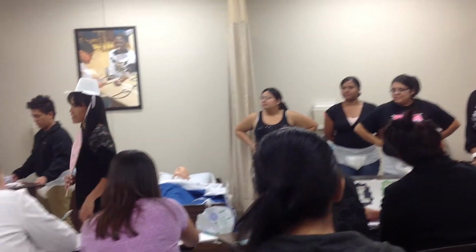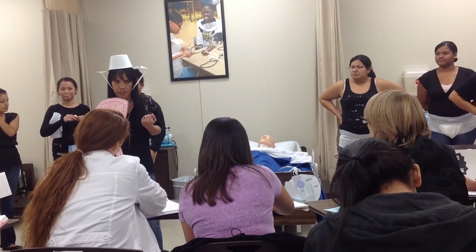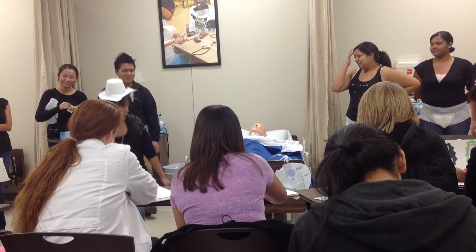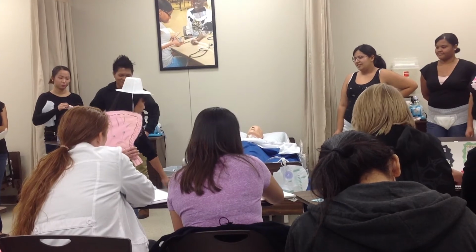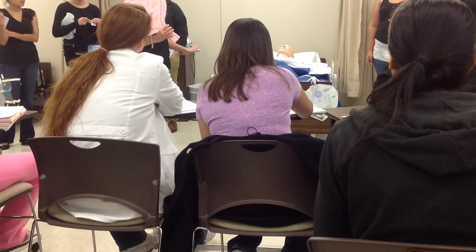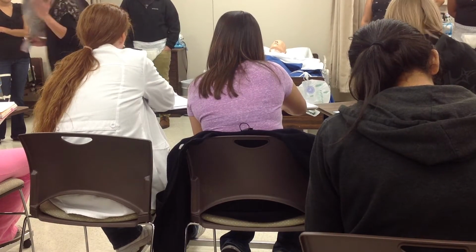So that's 5 N's. So in case we're walking with our patient, we're helping our patient, and the patient has the catheter. Do not bring, girls, do not bring your catheter like your purse. Let it down there, below the bladder, okay? And so you know where to put the catheter. As I said, it should be by the bed frame, not on the bed rail, or lay the tubing on the bed, the mattress, or kink it, or else it will trap the flow. And the other people will do the rest.